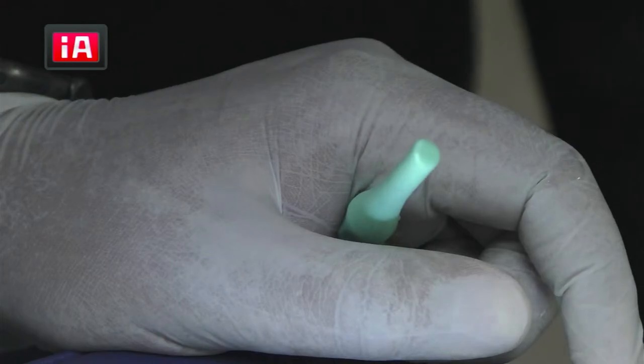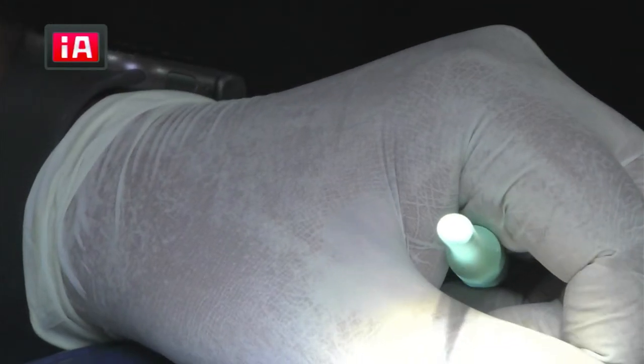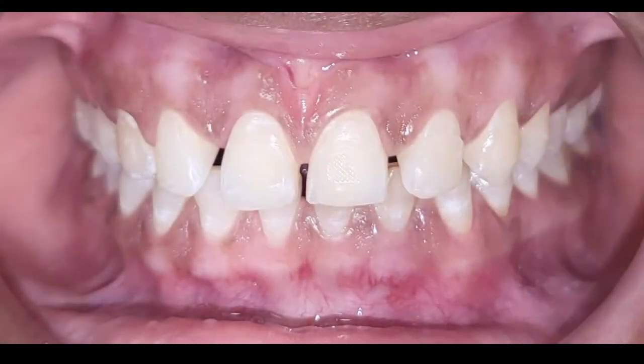Check now. Okay. This is the yellow band bur for the finishing. We'll use it at the end. So I'm going to use the micromotor. Just connect it, okay?